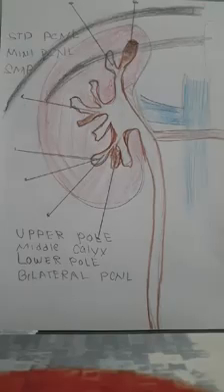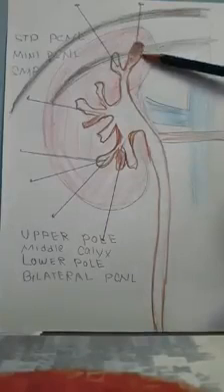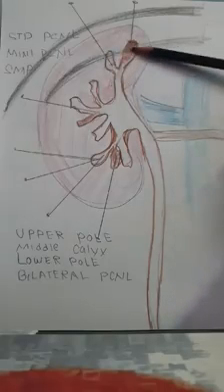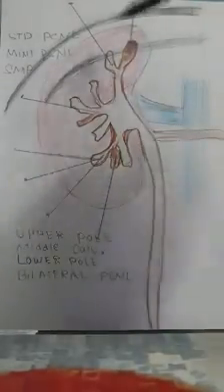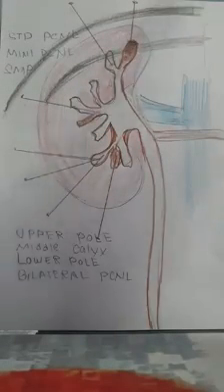For the puncturing technique, my favorite puncture is always the superior pole puncture, and I will tell you why I prefer it, and what advantages and disadvantages I have encountered. Let's see, this is the kidney, and here we have the superior pole. Let's suppose this is the posterior calyx of the superior pole, and this is the anterior calyx. We can go to the posterior calyx or the anterior calyx. After catheterization, in the prone position, I always want to do a superior pole puncture. I don't do a superior pole puncture in the supine position.